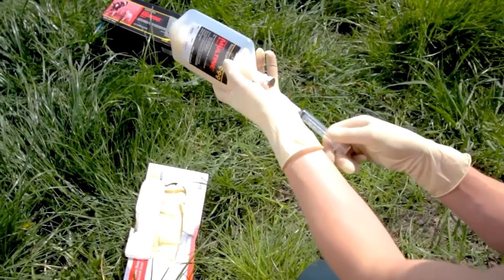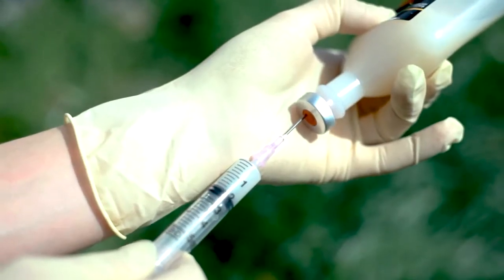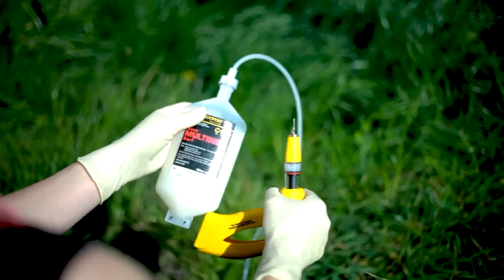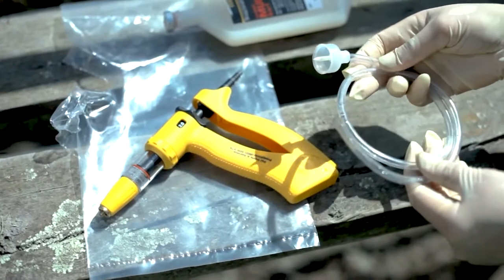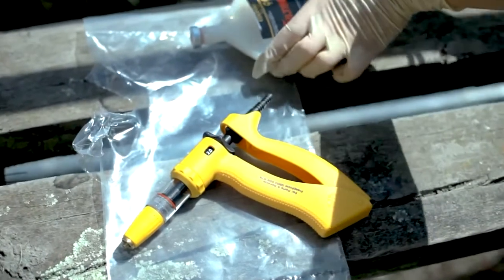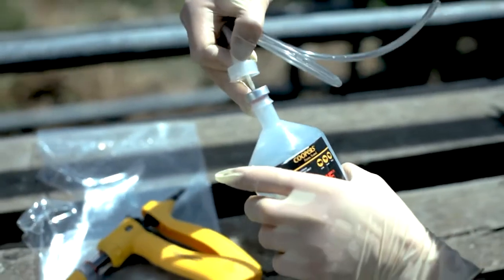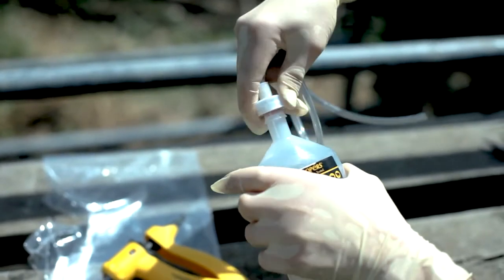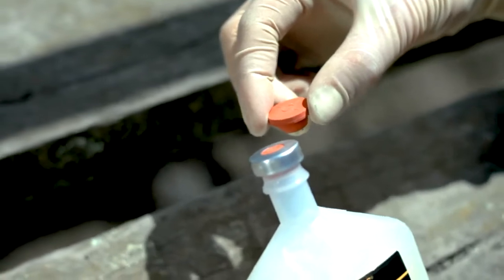Traditionally, a single needle and syringe were used to draw up vaccine and administer to the animal. It is now routine to use a vaccinator gun attached to the VaxiPack. When using a vaccinator gun, attach the draw-off tube by piercing the rubber stopper of the VaxiPack. The rubber stopper should be pierced centrally, as shown, at the thinnest point. Piercing near the outer diameter of the rubber stopper will cause difficulty due to the thickness of the rubber in this region.